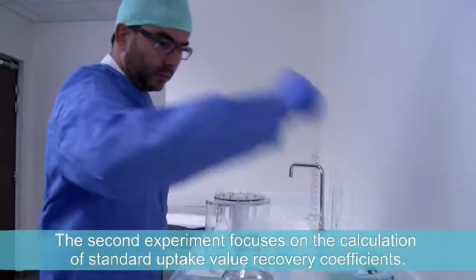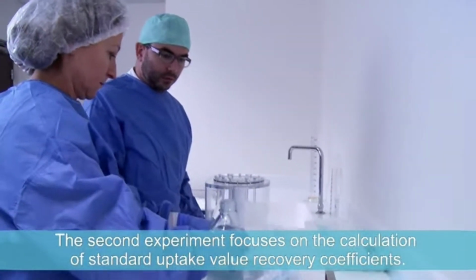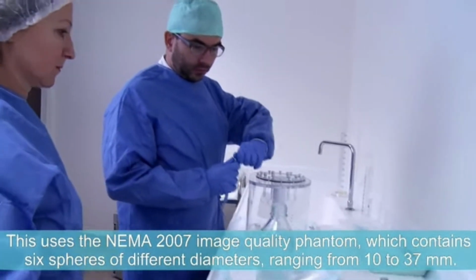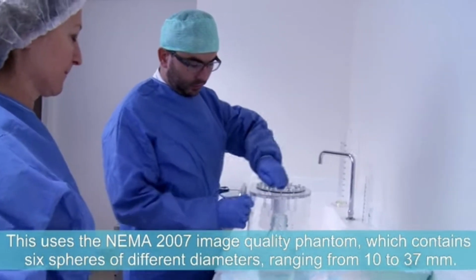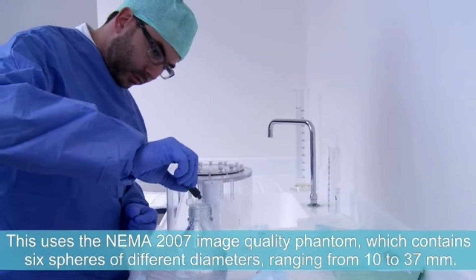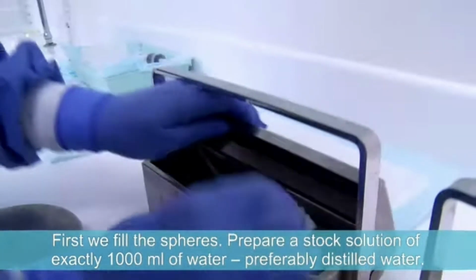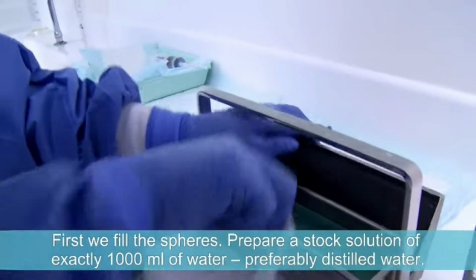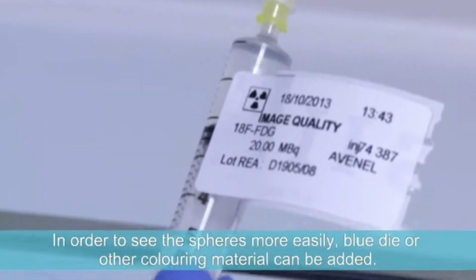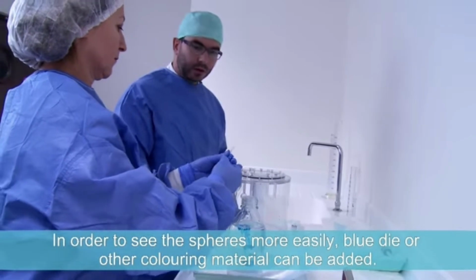The second experiment focuses on the calculation of standard uptake value recovery coefficients. This uses the NEMA 2007 image quality phantom, which contains 6 spheres of different diameters ranging from 10 to 37 millimeters. First, we fill the spheres. Prepare a stock solution of exactly 1,000 milliliters of water, preferably distilled water. In order to see the spheres more clearly, blue dye or other colouring material can be added.